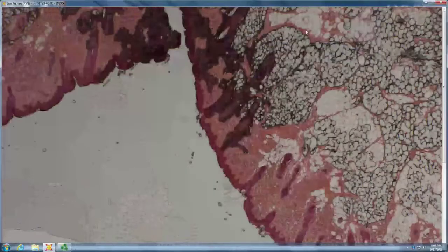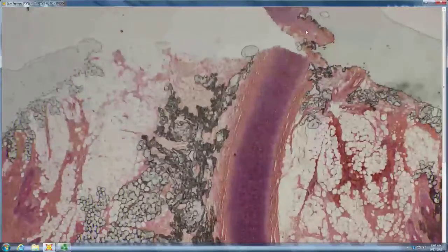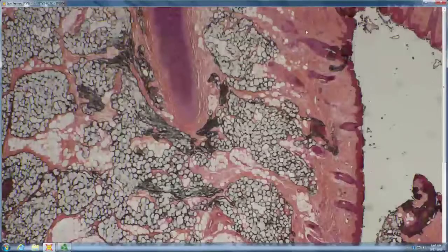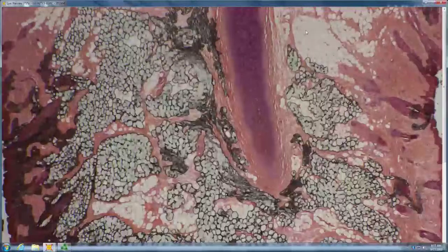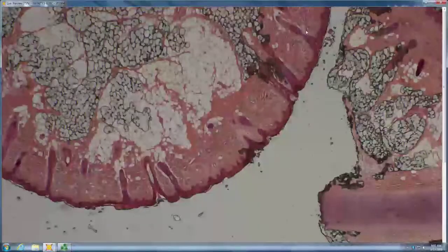So they still have that high up, and then there's some cartilage there. Is this a very thin worm-like lesion with a cartilaginous core, or is it a bump? Probably a bump, with a cartilaginous core and tiny little hair follicles. A little accessory tragus, very good.